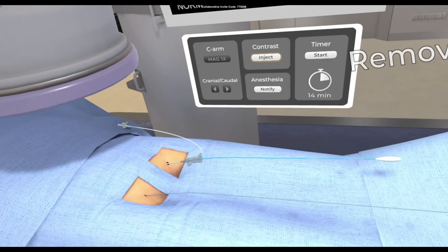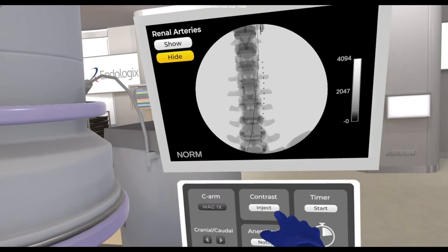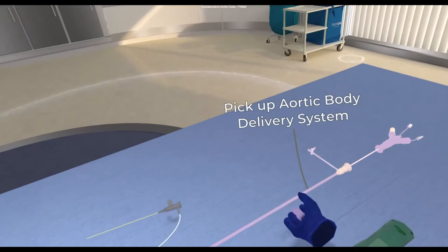You have to manipulate, position all of these devices. There are prompts, so it's a unique way of actually training you. There are prompts which come up in front of you to say, hey, Dr. Lumsden, you forgot to do this, now you need to go back and do that. And how I can actually insert these devices. This is the devices inside that catheter. That catheter is threaded on the guide wire.